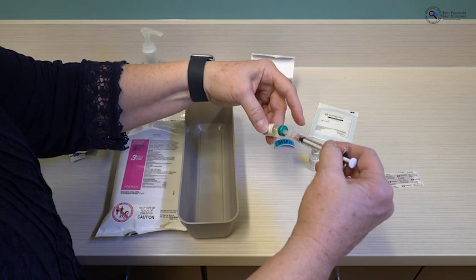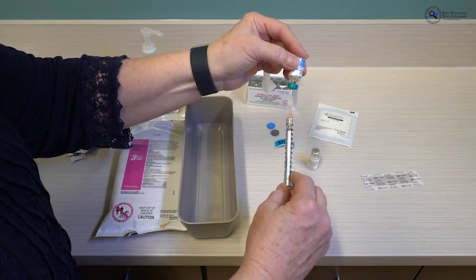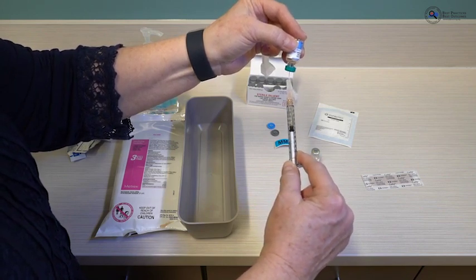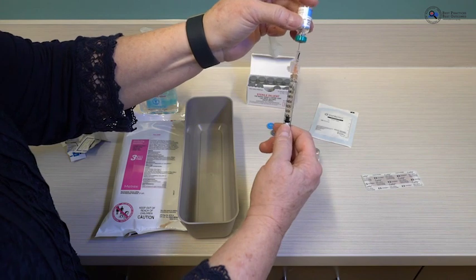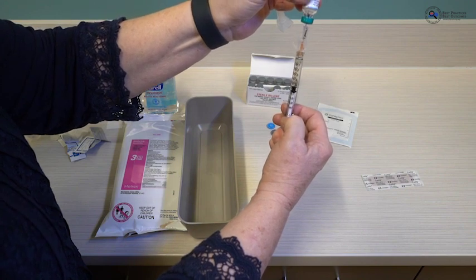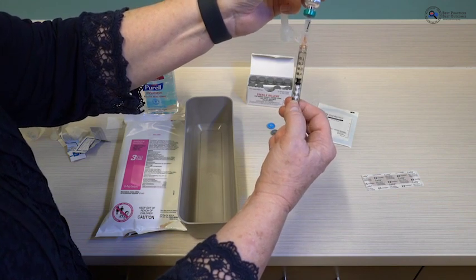After the vaccine has dissolved, you can tell that the MMR vaccine has a very faint amber tint — that is normal. Tilt the needle to the side and make sure the tip is well below the level of the fluid in the vial, so you fill the syringe with vaccine and not with air. The desired dose for MMR is 0.5 cc's. Make sure you have no air in your syringe; if you do, inject it back into the vial. Then confirm the top of the plunger is directly across from the 0.5 line.